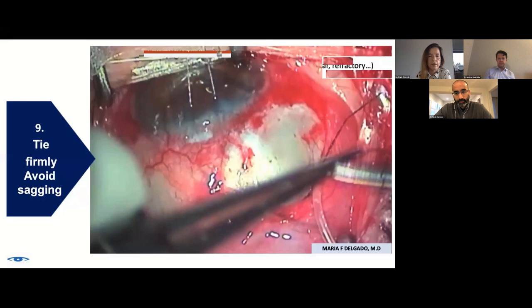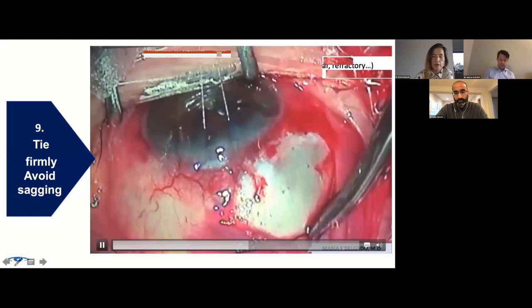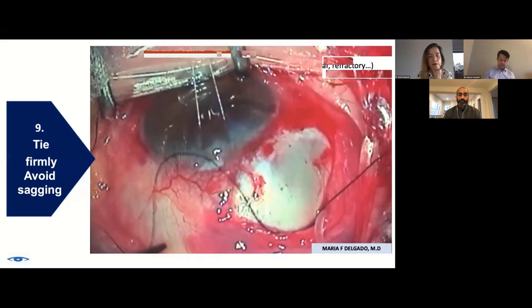This is a very thin sclera, multiple retina surgery, so be careful. But then you look and you see that actually your knot is behind the end of the plate, and then you're safe to continue doing some knots and tie it firmly, and then cut. And of course, the knot will be hidden behind the plate.